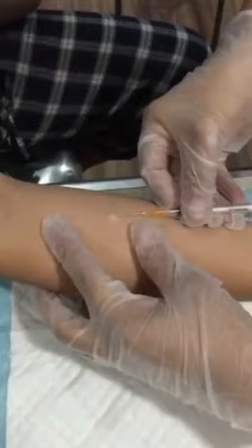Withdraw the needle quickly at the same angle at which it was entered. Activate the needle safety device. Apply a bandage if indicated. Do not massage the area because massage can disperse the medication into the tissue or out through the needle insertion site.